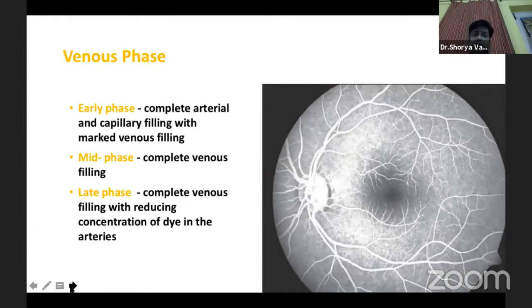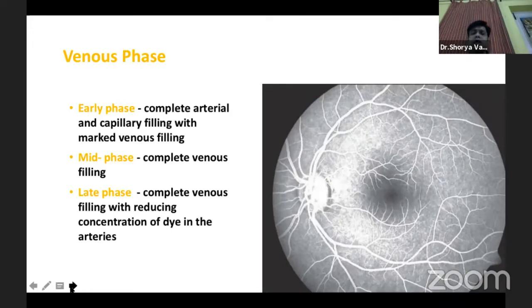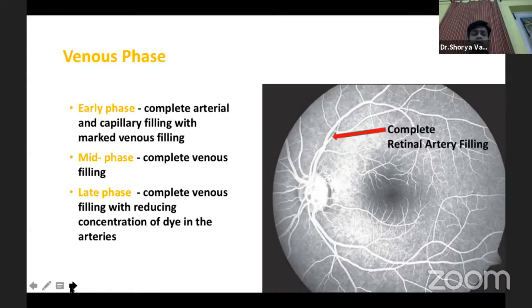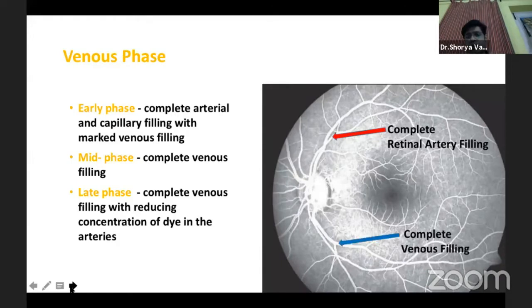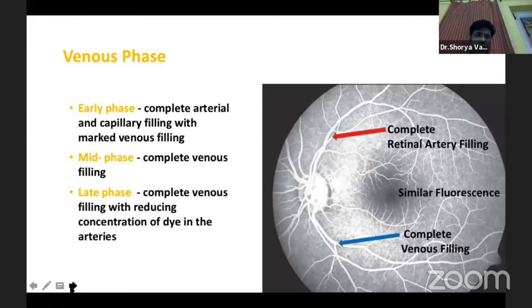Then comes the venous phase, which can be divided into early, mid, and late phase depending on the fluorescence of the vein compared to the artery. If the artery fluoresces more than the vein, it is the early venous phase. If both show the same fluorescence, it is the mid venous phase. If the vein fluoresces more than the artery, it is the late venous phase. In this photograph, both show complete filling with similar fluorescence, indicating mid venous phase.